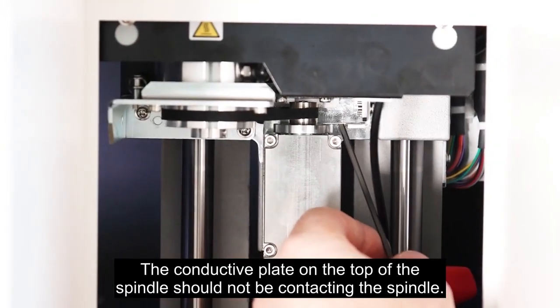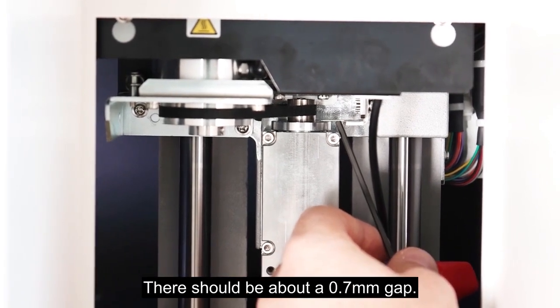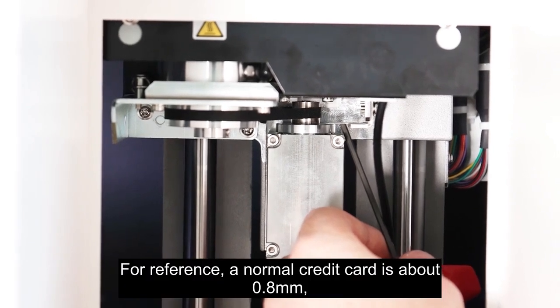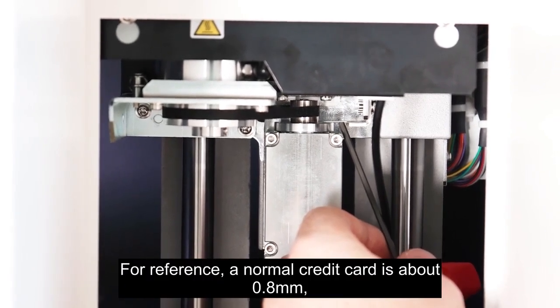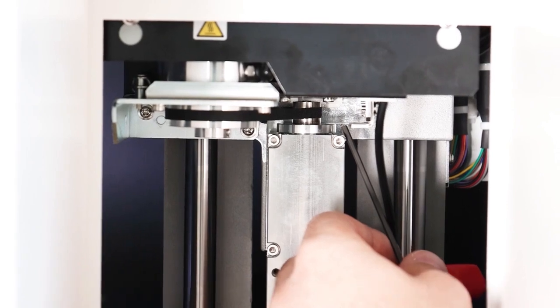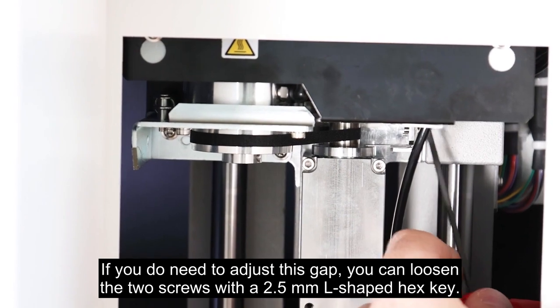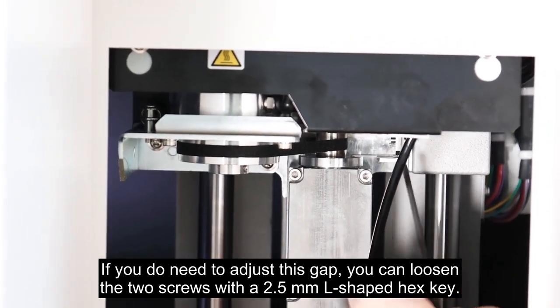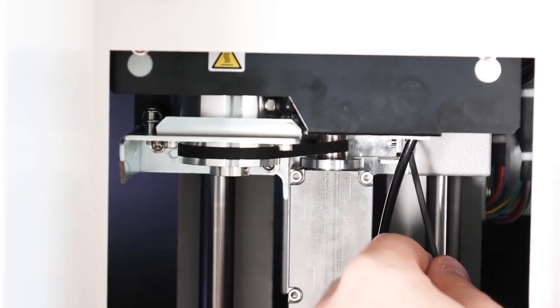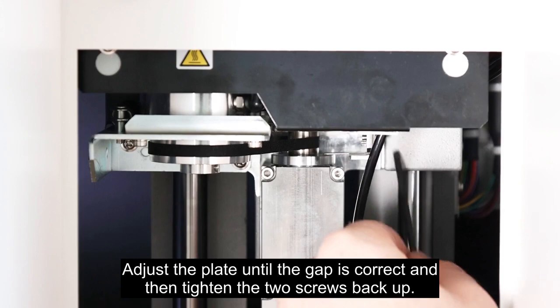The conductive plate on the top of the spindle should not be contacting the spindle. There should be about a 0.7mm gap. For reference, a normal credit card is about 0.8mm, so this gap should be a little bit less than a normal credit card. If you do need to adjust this gap, you can loosen the 2 screws with a 2.5mm L-shape hex key. Adjust the plate until the gap is correct and then tighten the 2 screws back up.